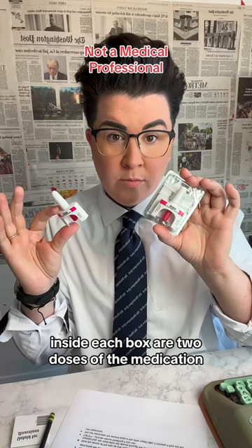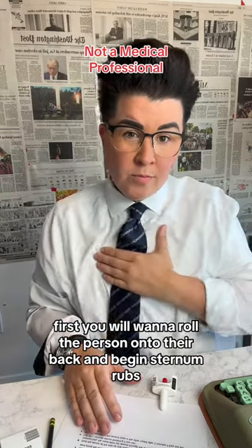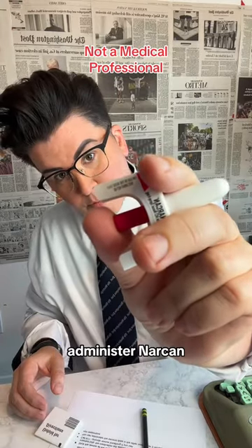Inside each box are two doses of the medication. First, you will want to roll the person onto their back and begin sternum rubs, trying to stimulate them awake. If they do not respond, administer Narcan.